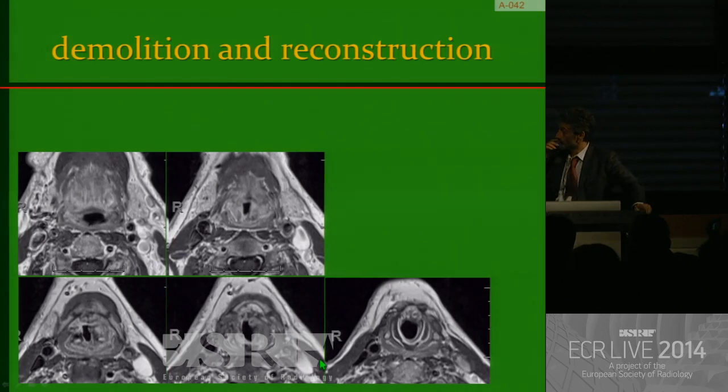And of course, this kind of reasoning applies also for the larynx. When you have a patient treated with an open access for laryngeal carcinoma, you have to count all the normal structures you would expect in a larynx to understand what has gone and what has been left. If you look at this image, no remnant of the epiglottis. You have the hyoid bone, but no thyroid cartilage.